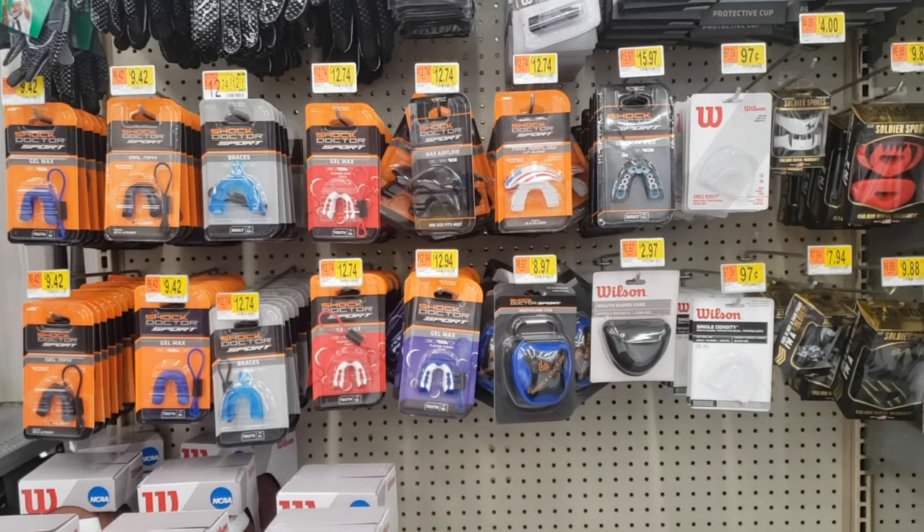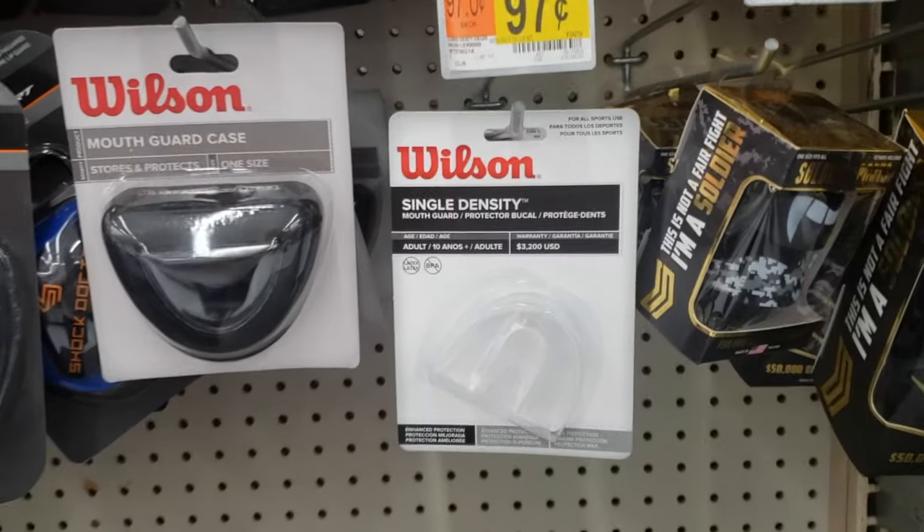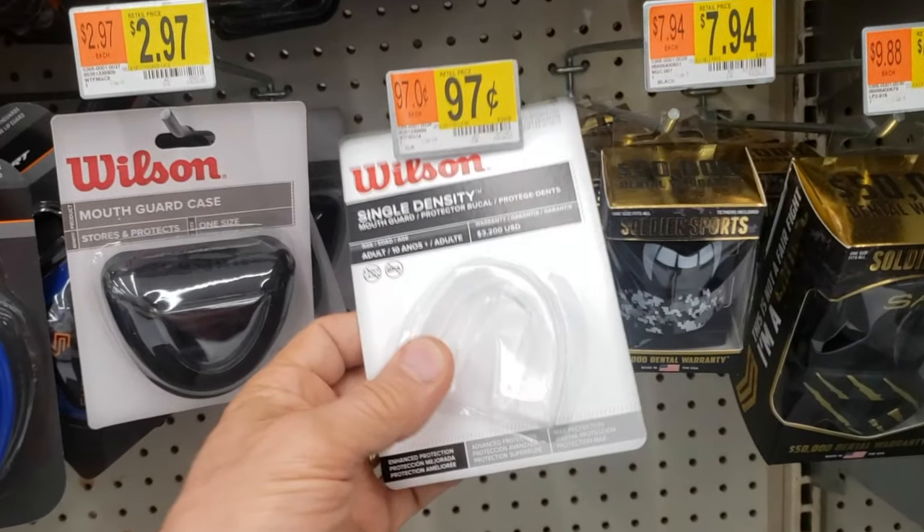What I normally do is go to Walmart. They have mouth guards ranging in price from $12.99 down to my favorite, Wilson, for 97 cents. I grab one of these and we're good to go.